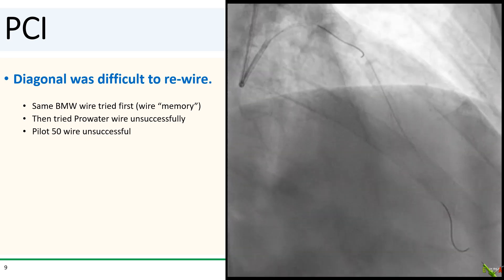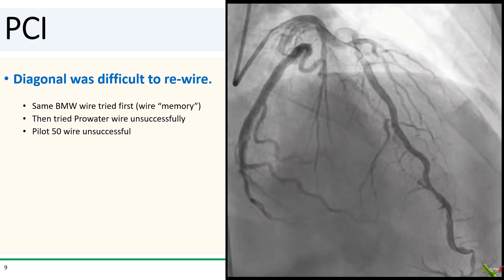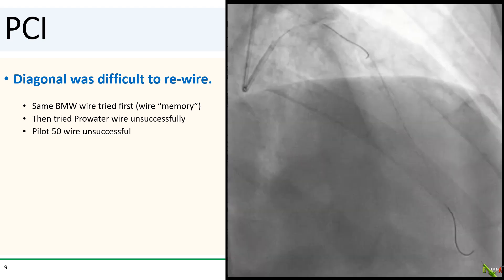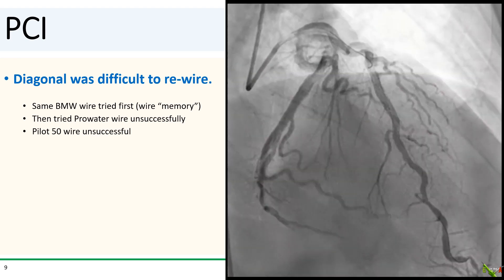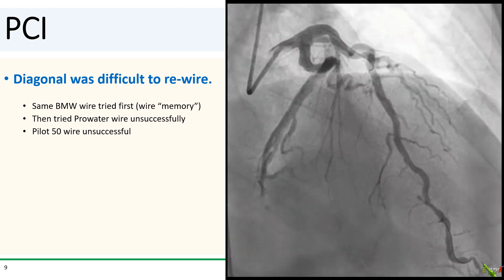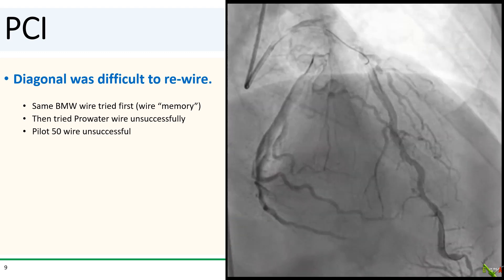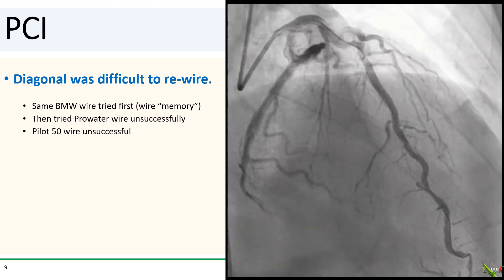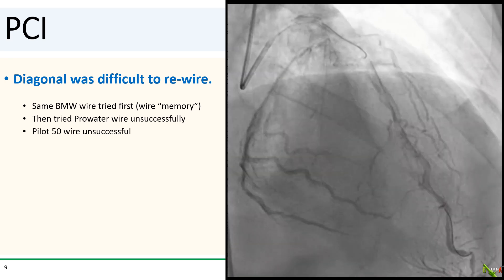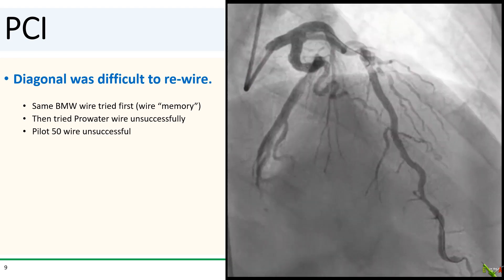Rewiring that diagonal turned out to be quite a challenge. That sharp turn in the LAD just proximal to the diagonal kept biasing the wire away from the ostium of the diagonal, and the freshly placed stent really didn't help matters. I tried the same BMW wire first — sometimes a wire that has already been in a vessel tends to find its way back in — but that didn't work. I tried increasingly hydrophilic wires, a ProWater and then a Pilot 50, but those didn't work either. Meanwhile, the patient was getting more distressed and kept moaning and squirming on the table in pain.